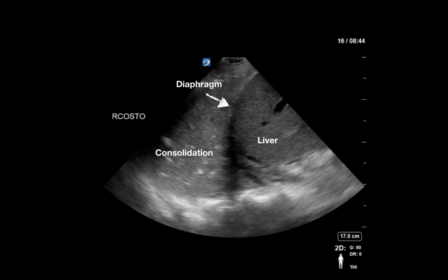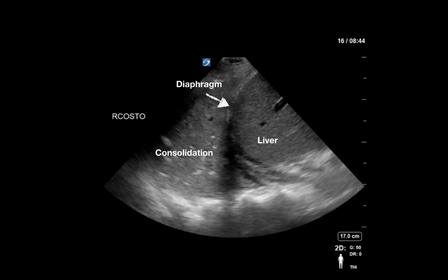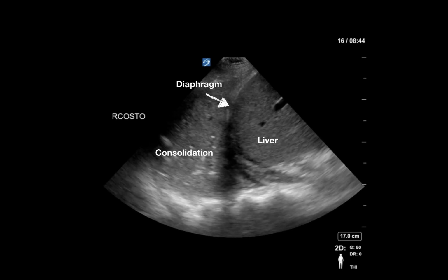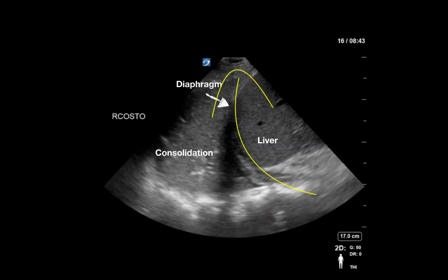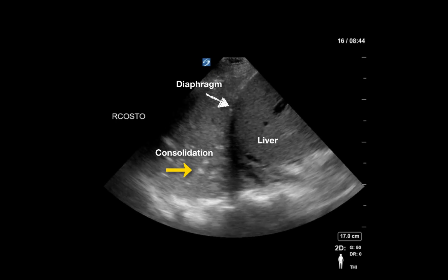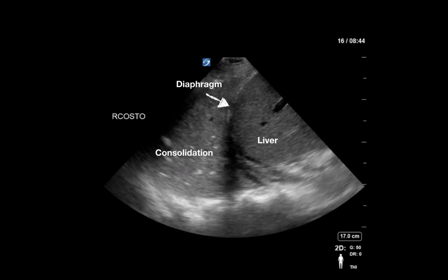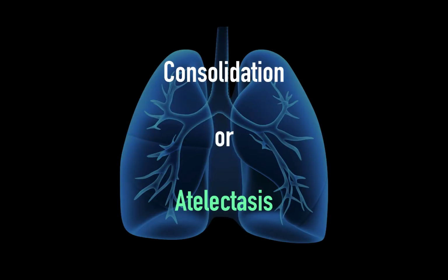Consolidations can look like a hepatized lung on ultrasound. However, a consolidation without surrounding fluid can be difficult to identify properly. A standardized view is critical. Ensure that the probe marker is cephalad or towards the head and that the screen marker is on the left. Identify the diaphragm well to establish what is pleural versus in the abdominal cavity. The main distinguishing feature, other than the diaphragm, is bright punctiform lesions that represent air-filled bronchioles surrounded by tissue and anechoic pulmonary vasculature. It can be challenging to differentiate consolidation versus atelectasis.